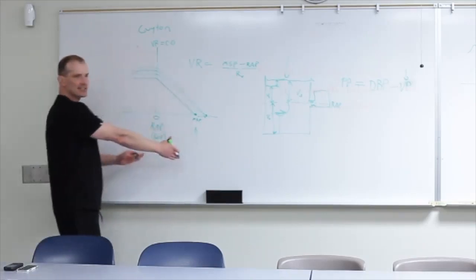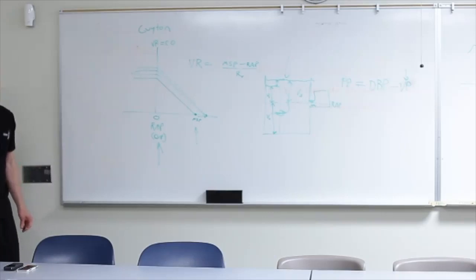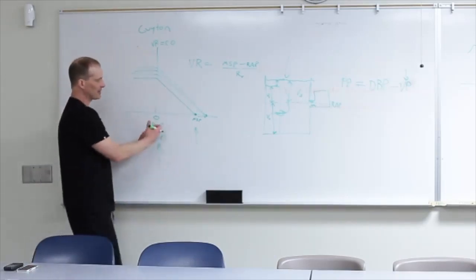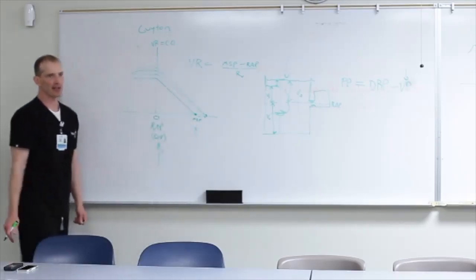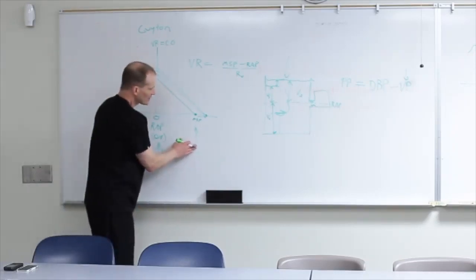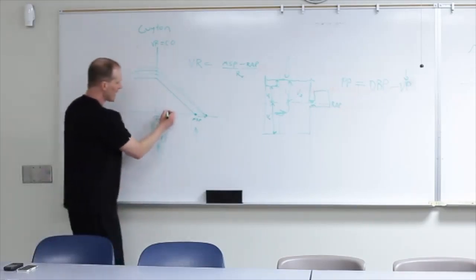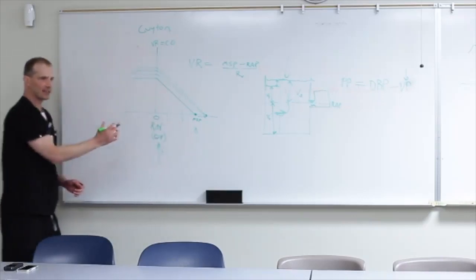People try to look at the IVC and guess what's going to happen with the left ventricle, okay? So I think this is the wrong approach. In other words, people will look at this and ask, can I predict volume responsiveness? I think if you're here, it's almost 100% you're going to be volume responsive. And if you're here, it's almost 100% that you're not going to be volume responsive. But what's happening in between, it gets hazy, okay?